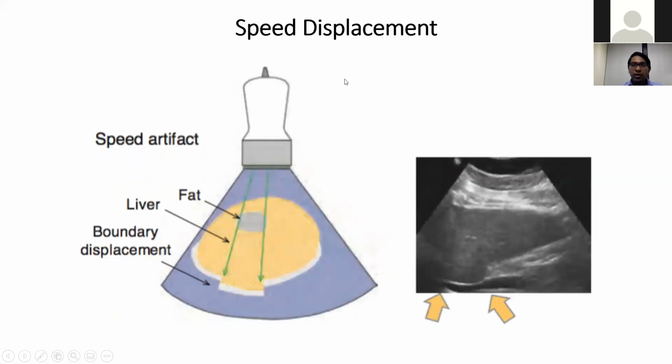One common problem is that we have to estimate the speed of sound when we are beamforming, because to estimate the delays, we know the distance between a point and the element that we are interested in, but we also need to know the speed of sound to calculate how much time delay we want to apply to a particular element. And that's where the speed of sound plays an important role.